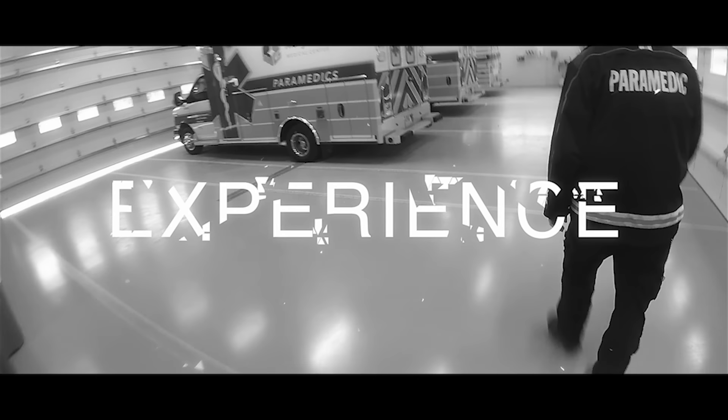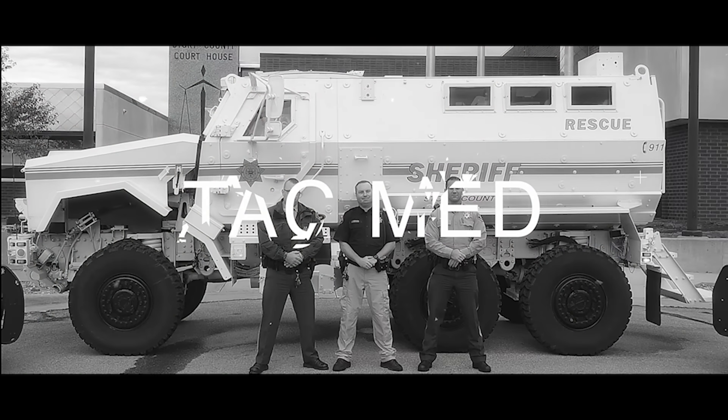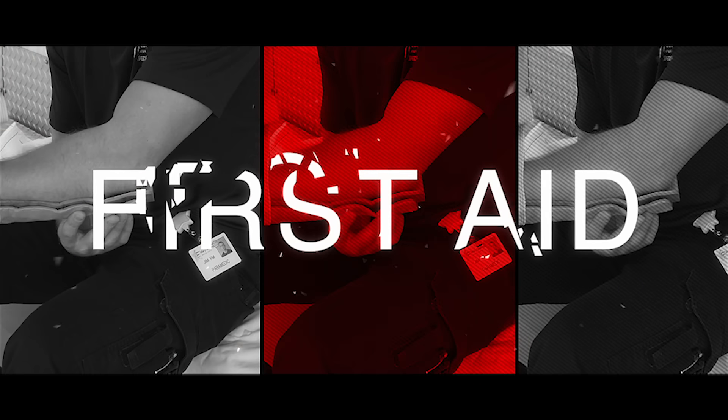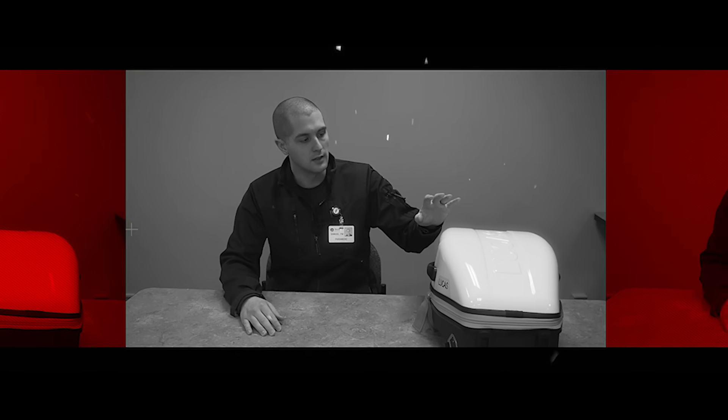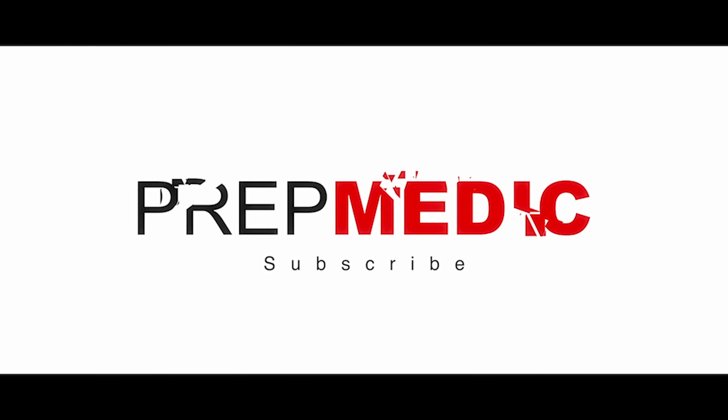Hey guys, my name's Sam and welcome to PrepMedic. In this week's video, I'm giving you a walk around of our brand new Horton Ambulance. One of the most requested videos I've had over the last couple months is to do a walk around video similar to the one I did while I was at Mary Greeley of the new rigs that we got at my agency up here in Colorado.